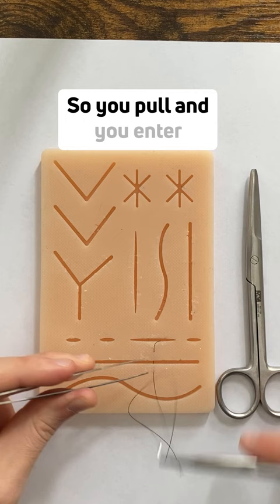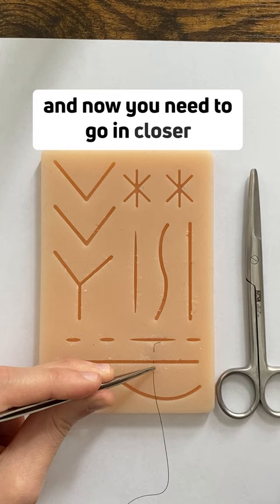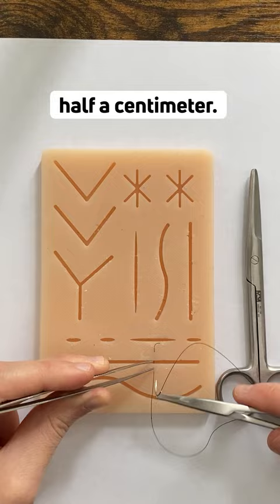You pull, and enter around half a centimeter from the edge of the skin. Remember, you entered far and far — now you need to go in closer and come out closer. So if you entered at one centimeter, you go in here at around half a centimeter; if you enter at half, you exit at half on this side.